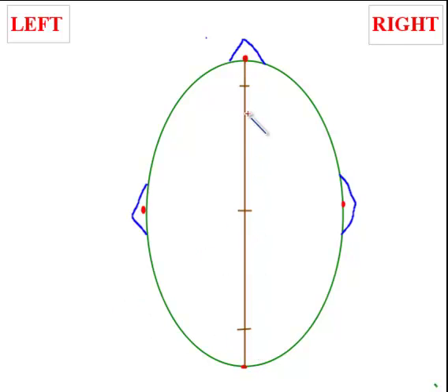And then you calculate the distance between this point and this point, and you put a mark here, and between these two, you cut it at this midpoint.